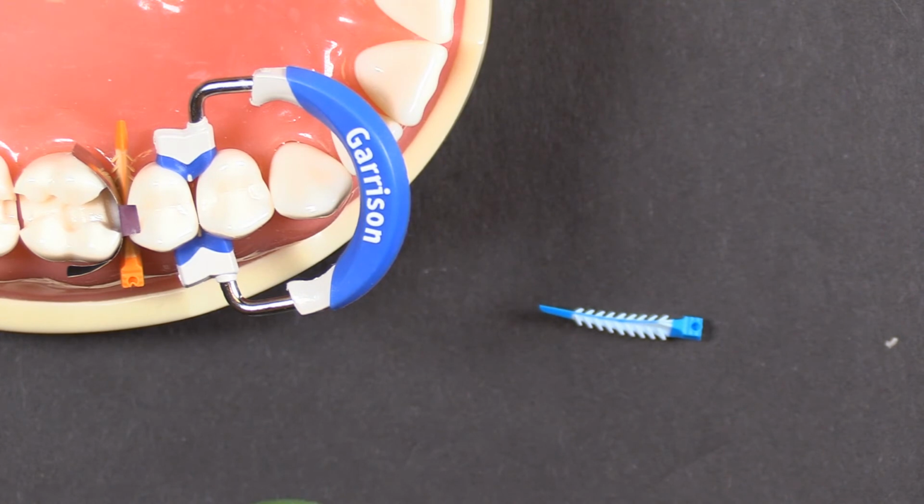Another tough question was, what do you do when the tooth you're trying to restore isn't in full contact with the adjacent tooth to begin with, and you've got a little gap that you're trying to fill? How big of a gap can you cover with a sectional matrix system? According to the folks I talked to about that, about 2 millimeters. Nothing more than about 2 millimeters with a sectional.